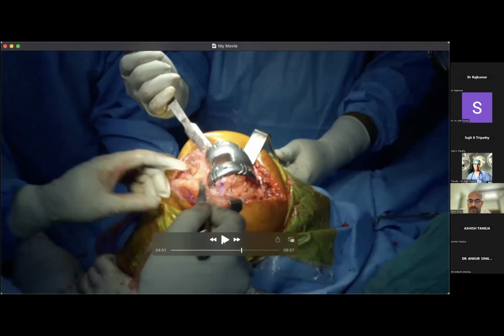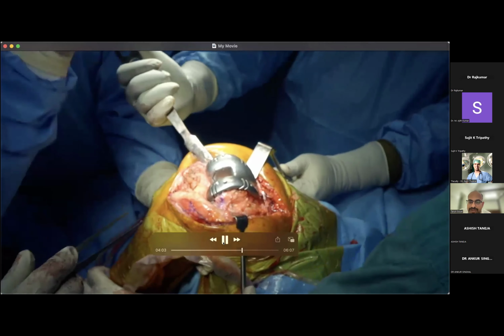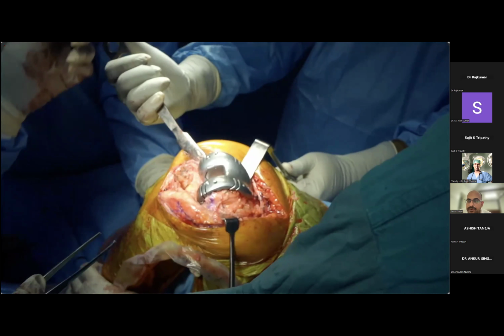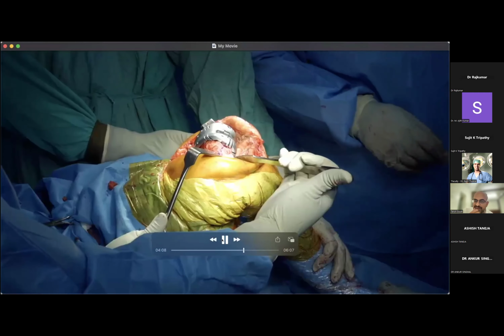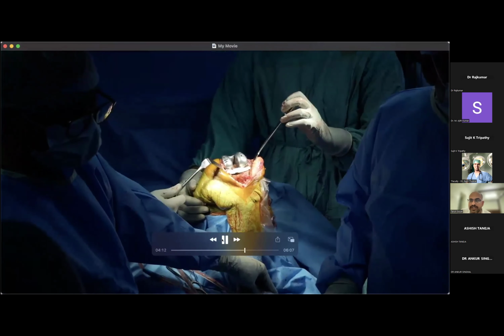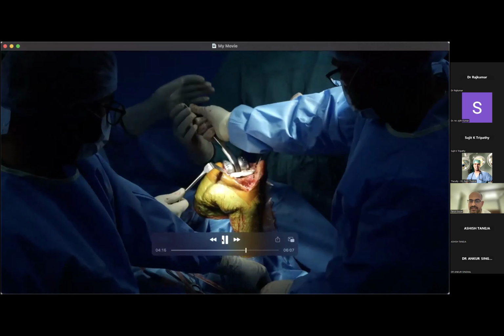Again, this is the femoral component in place, and we can see that there's a defect on the posterolateral side of this component. The horizontal lines on this femoral component will also tell us whether it's a 5 millimeter gap or a centimeter of gap that we are looking at. On the medial side, the opposite side, there was no defect. The femoral trial was absolutely touching the bone both anteriorly and posteriorly, as well as distally.